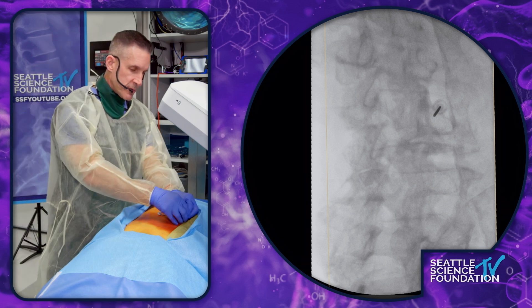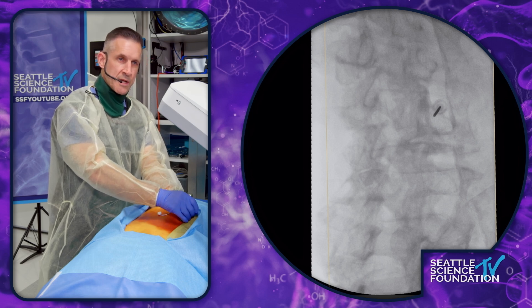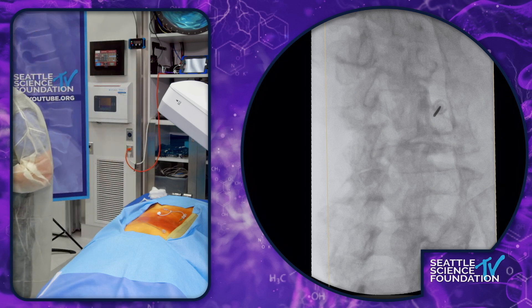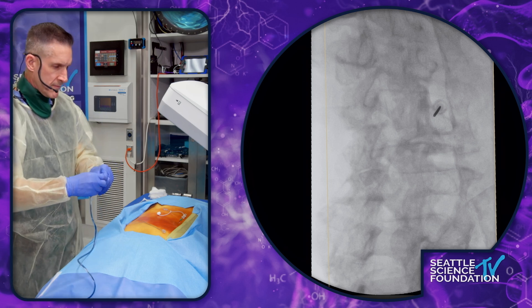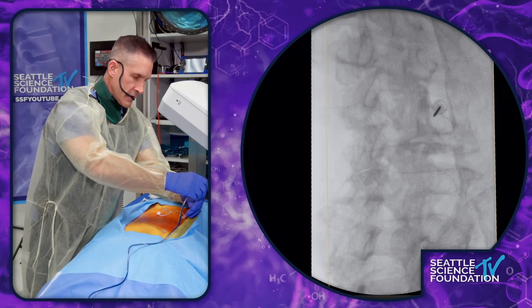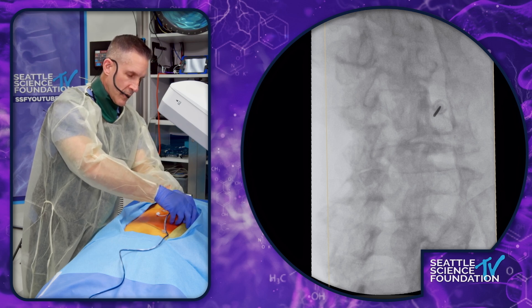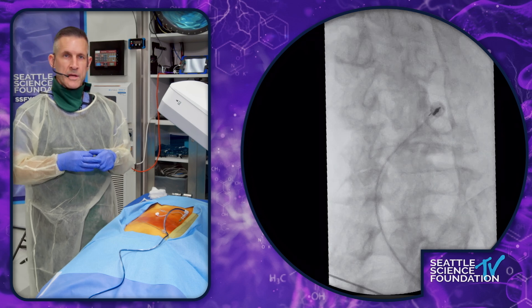Basically, you place this in, get down to bone, then back it off just a little bit, because remember it has a distal projection. Then you come to your probe, and your probe attaches to the generator. All you have to do is take this and click it on here. I want to be just right off the bone. And that looks like money.